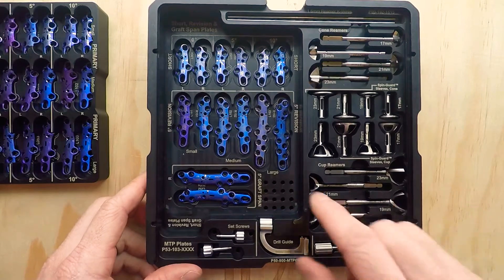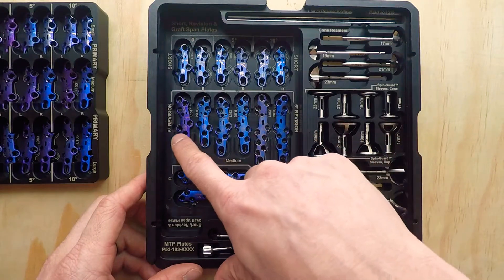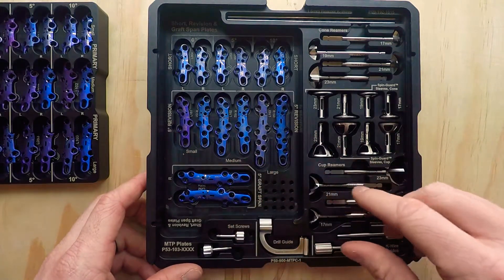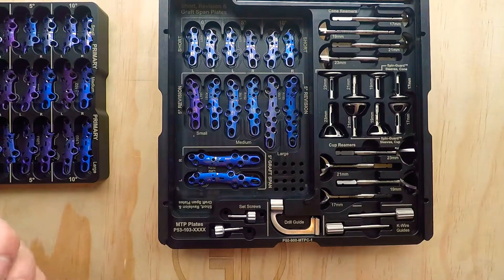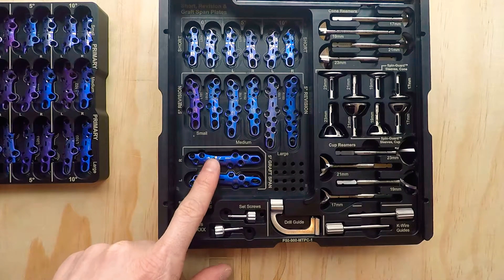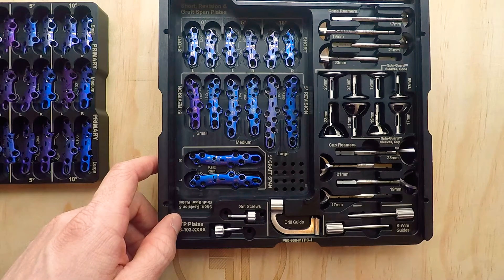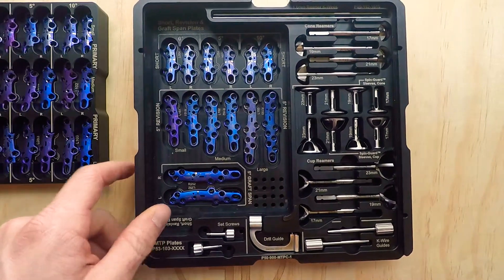Down below, these are our revisional plates. We have small, medium, and large options, right and left, with five degrees of dorsiflexion built in. Below those, we have our graft spanning plates. In a different video, I will show our options for the trials and even a demonstration plastic imitation graft of our MTP disc, so you can get an idea of why we created the graft spanning plates. These are designed to span a graft for a complex primary or a situation where you need to add length for the procedure.